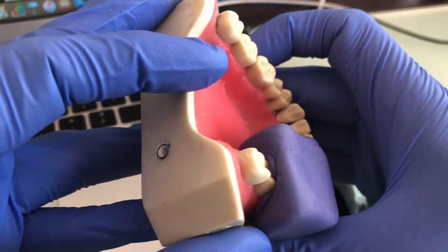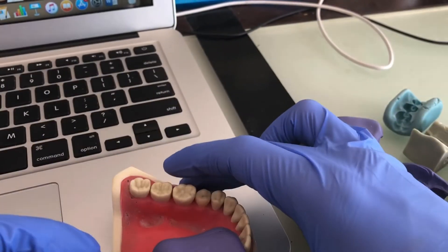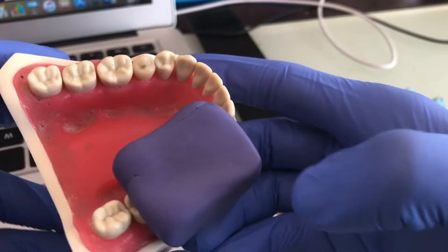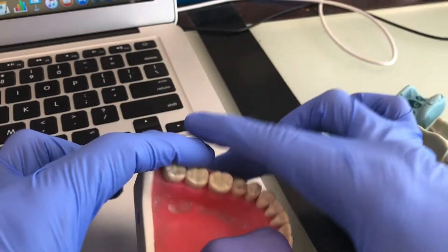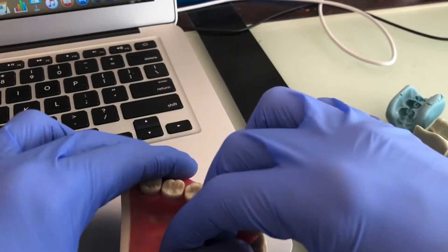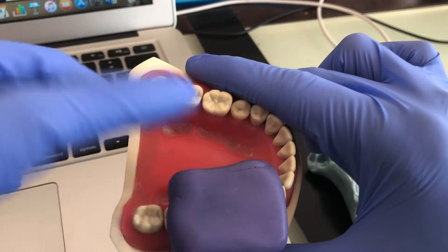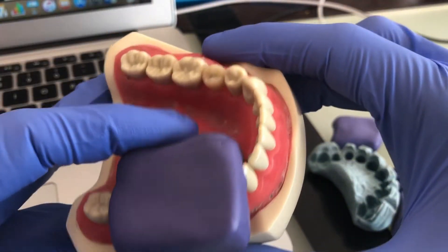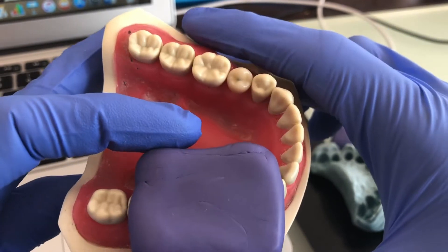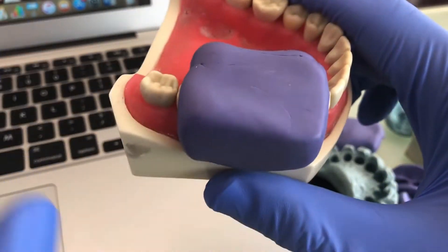This is completely set — rock hard — but I'll leave it another 30 seconds. My technique for seven minutes and three putties: once I feel one is about to set, I start mixing the next one straight away, so it's back-to-back. That way everything comes out done in seven to eight minutes. Even if you take a little longer, it shouldn't be more than 10 minutes for three putties.